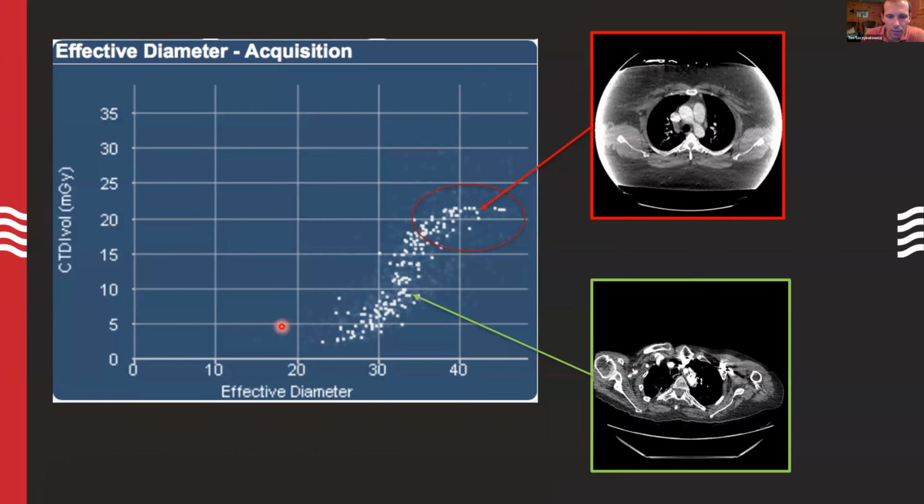So when we notice that, we can start to appreciate, if we look at aggregate dose analyses of dose versus patient size for a protocol that has a problem, we might start seeing something like this. By having a problem, I mean we've kind of flatlined out in our dose up here. In other words, probably the scanner would have wanted to give more dose for these larger patients, but it wasn't able to, so it kind of flatlined out. In other words, everyone over like 40 centimeters effective diameter on this plot here, we're all getting the same dose. The scanner has reached its maximum. It can't do any more.